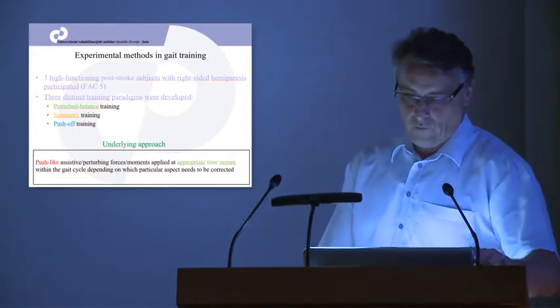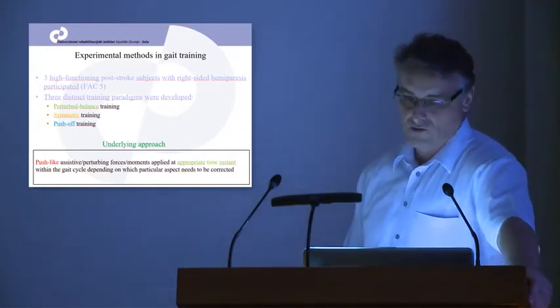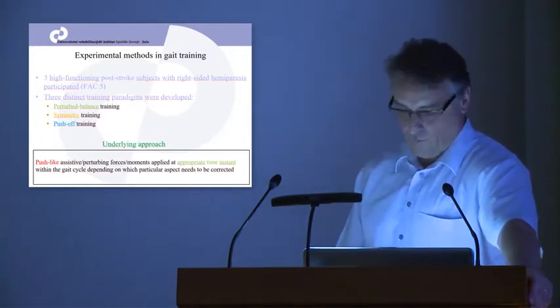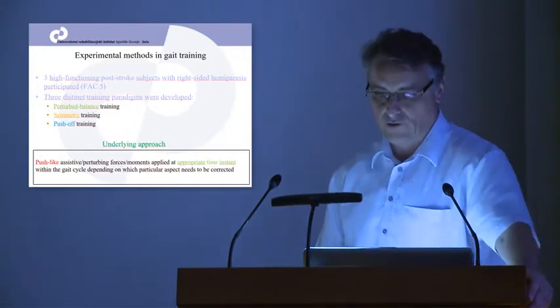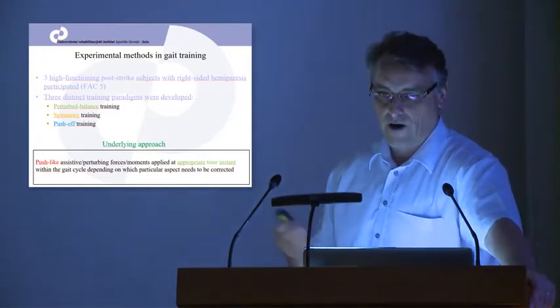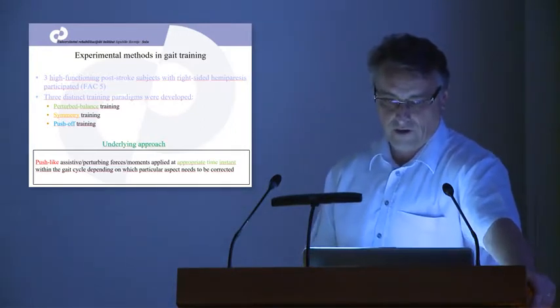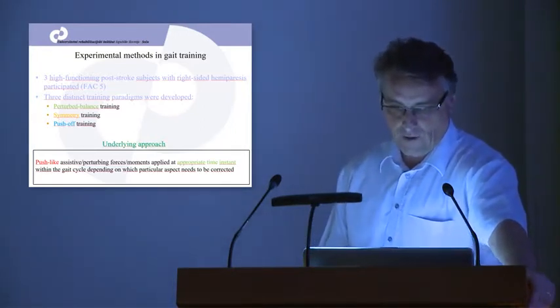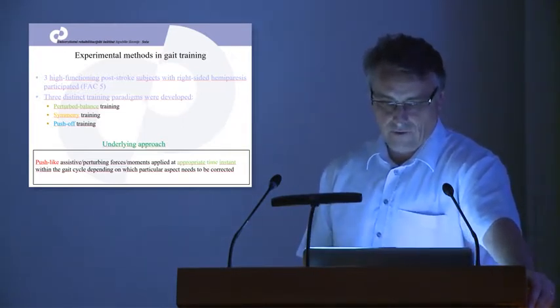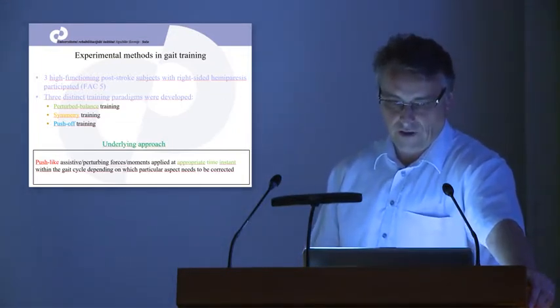What I will present mostly today is the ongoing work that spans several research projects, one being Balance, which has already finished. I will talk about three high-functioning post-stroke subjects who had already completed rehabilitation at our institution prior to enrollment in this experimental program. They all had functional ambulation category 5, and we focused on three distinct training paradigms: symmetry training, push-off training, and perturbed balance training.